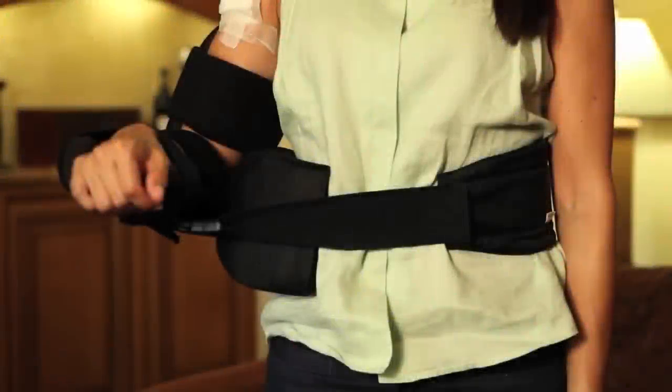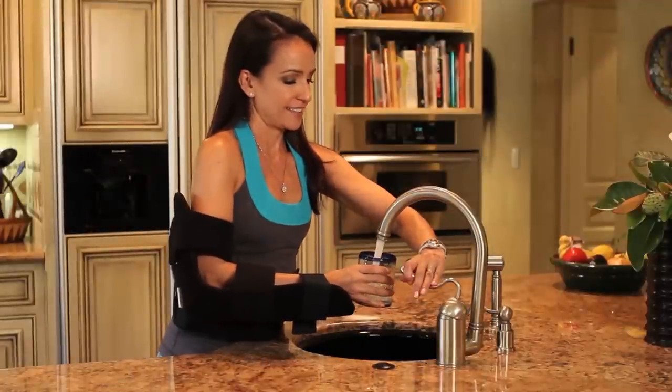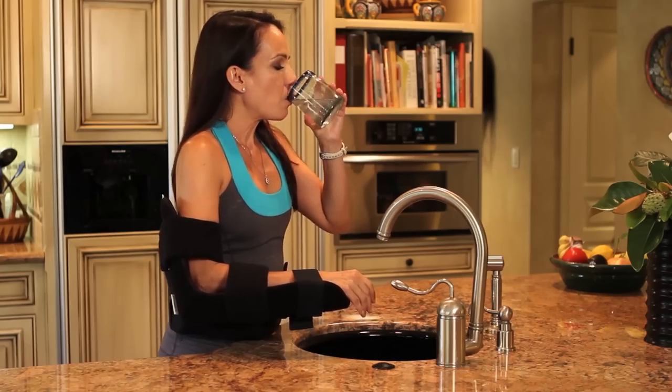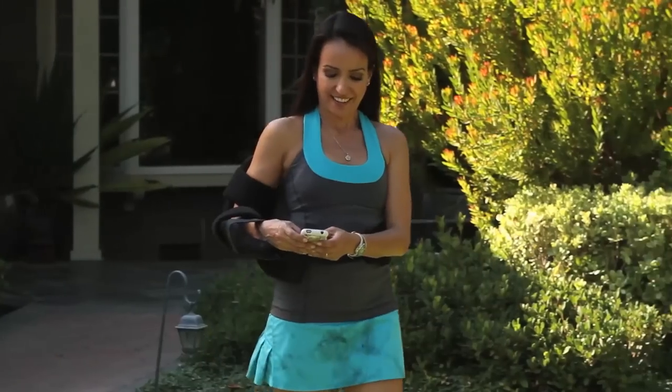The Shoulder Cradle is designed to maintain the shoulder in a position of neutral rotation, which is not only the optimal position for proper healing, but also beneficial for carrying out the activities of daily living, such as getting a glass of water, using a computer, and using mobile devices.